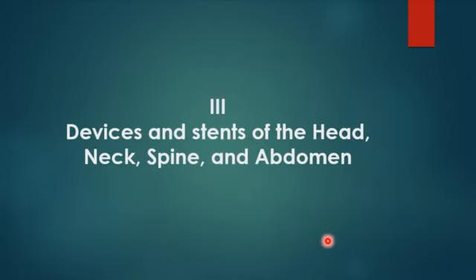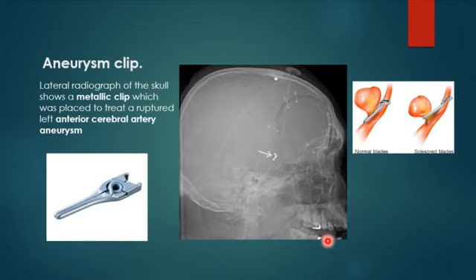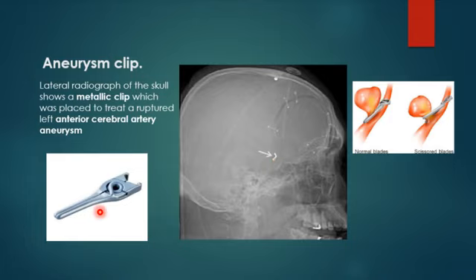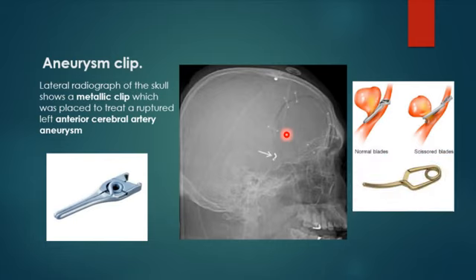Now we'll talk about devices and stents in adult patients outside the heart. Starting with aneurysmal clips: a patient with an anterior cerebral artery aneurysm undergoes surgical clipping. On lateral skull X-ray the clip is visible as a very small metallic clip. There are also clips from the removed portion of the skull, appearing in different shapes depending on how the aneurysm was clipped.